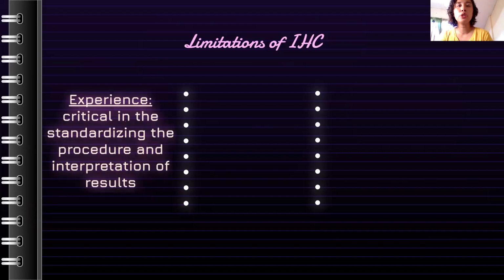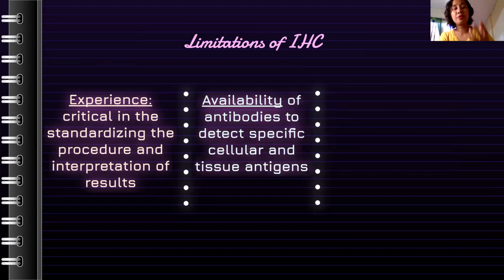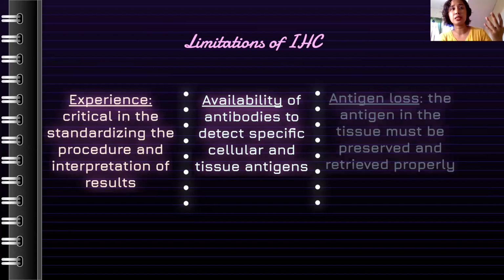So, limitations of immunohistochemistry, guys. Experience daw is critical. Pathologists who are really trained, medtechs who are really trained. When the medtech or histotechnician is well trained and the pathologist is well trained, and they have years of experience already, paganda ng paganda yung results. Also, the availability of antibodies. Isn't it that antibodies are expensive, class, mas na yung mga monoclonal antibodies? So it depends on the availability of the antibodies.